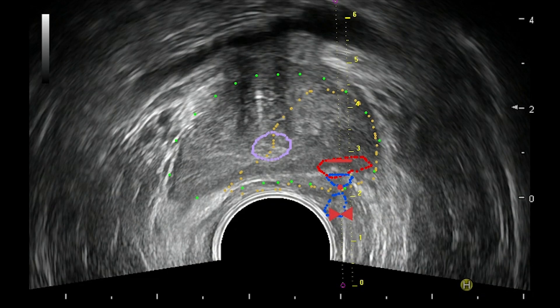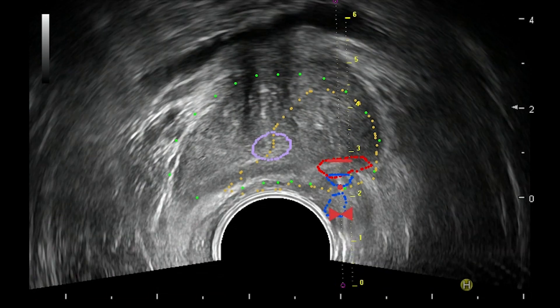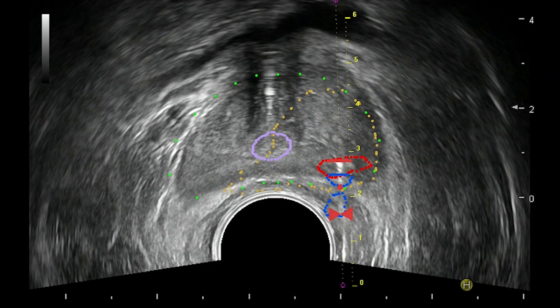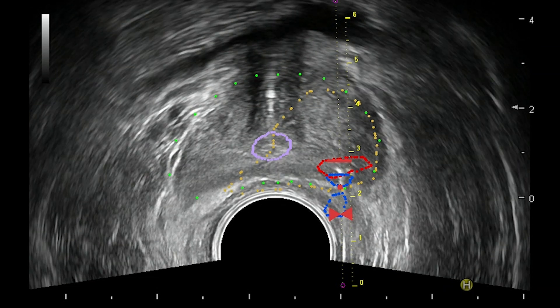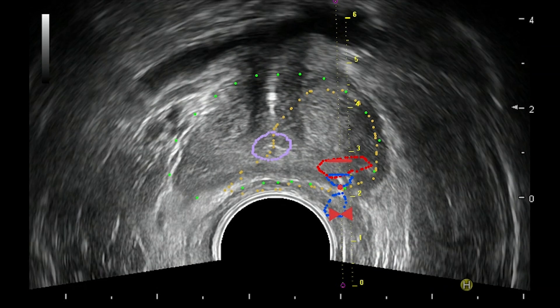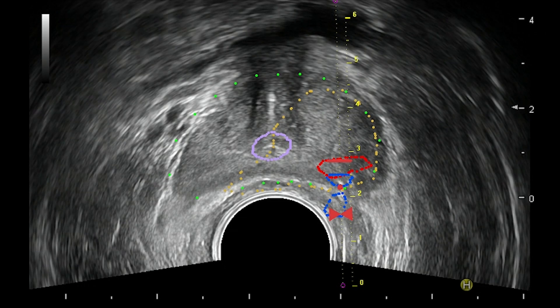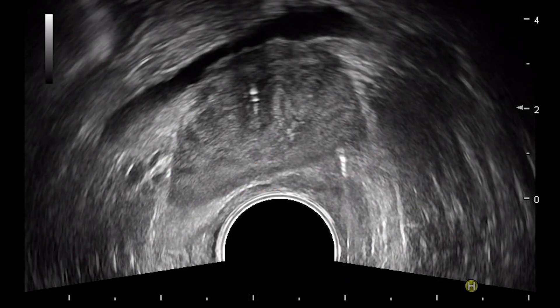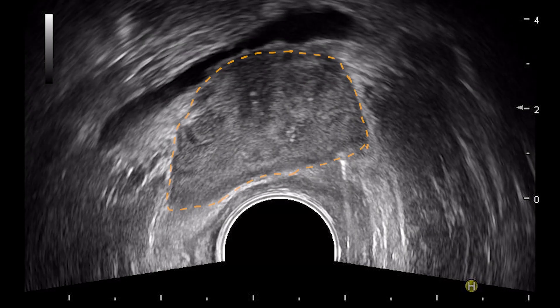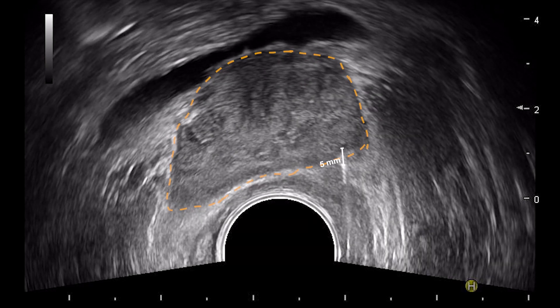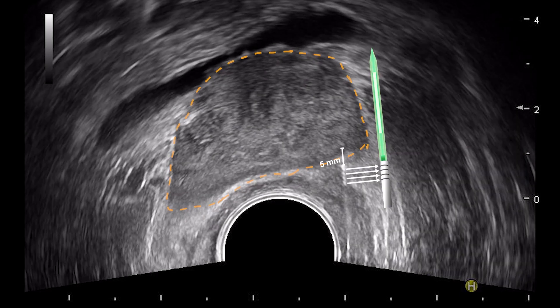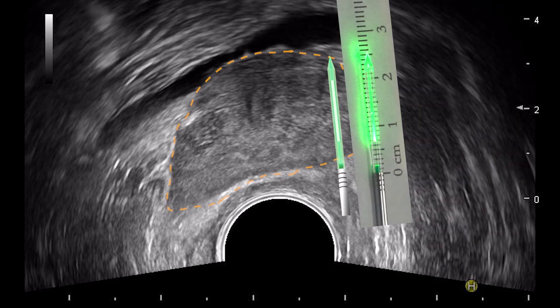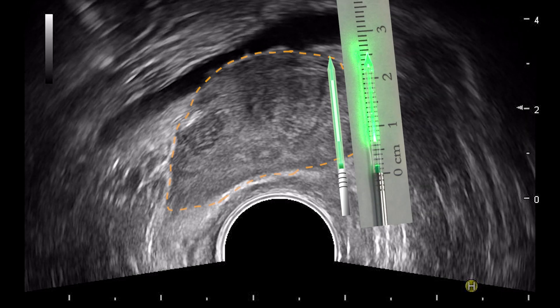Rotation of the laser catheter while penetrating the prostate capsule may facilitate insertion. The laser catheter is advanced until four echogenic markers pass centrally through the hourglass shape target. The prostate may shift relative to initial fusion with placement of the laser catheter. The depth of the laser catheter relative to the planned ablation can be evaluated on live ultrasound by referencing the prostate capsule. The ablation zone begins 5 mm distal to these echogenic markers and spans a treatment area 27 mm in length and 18 mm in diameter.